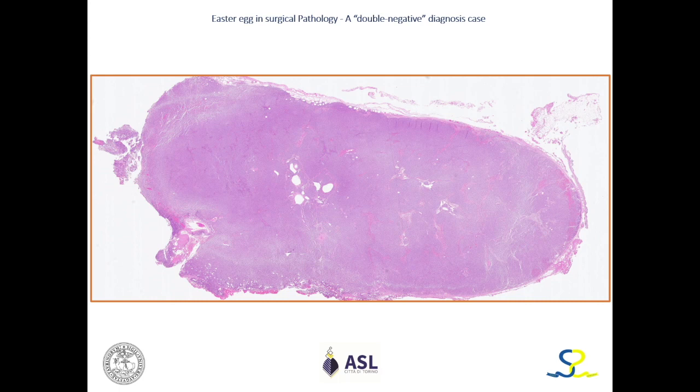Now, this is the hematoxylin and eosin stain, but first there is some advice I received and I would like to share with you. It regards lymph node sampling: when you have to do the grossing and sampling of a lymph node, do not take one of the biggest sections. The bigger the sample, the more frequent the trouble with all the pre-analytic phases, such as staining, but also immunohistochemical staining. If you suspect a lymphoproliferative disease, as in this case we do, always select a small section. It will be much easier to handle, but still representative.